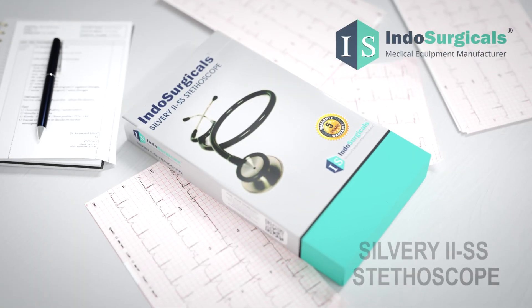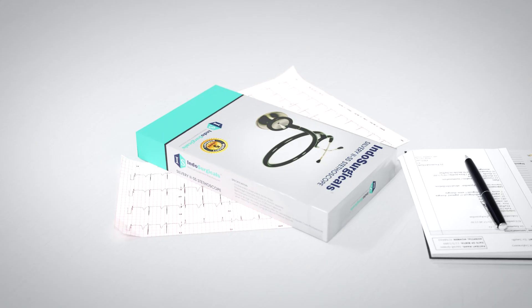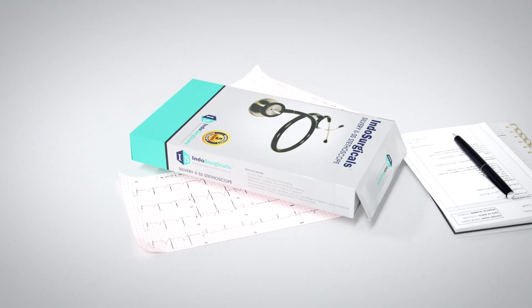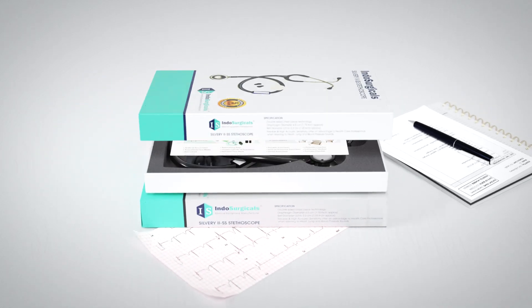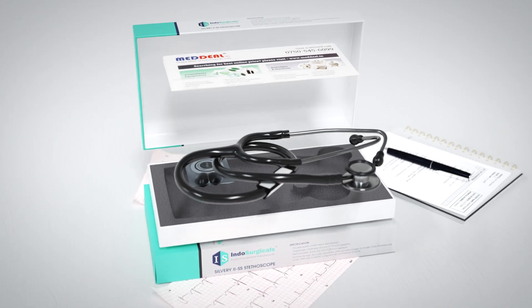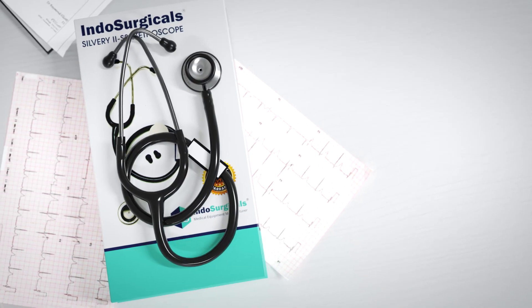Introducing the Indosurgical Stethoscope, a powerful and versatile medical instrument designed to enhance the auscultation experience for healthcare professionals. With its exceptional features and reliable performance, this stethoscope is a valuable tool in diagnosing and monitoring patients.